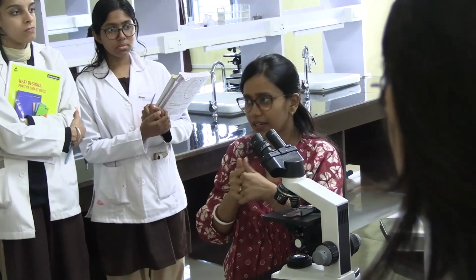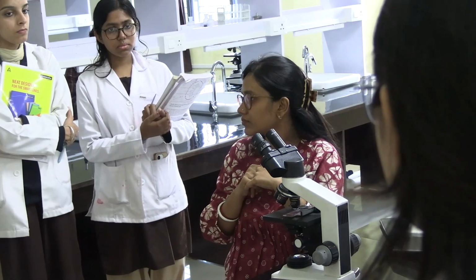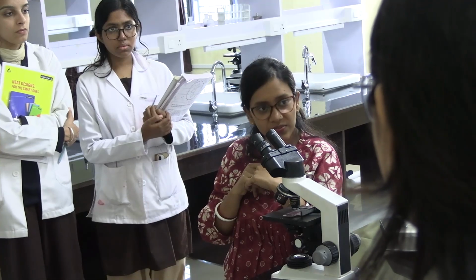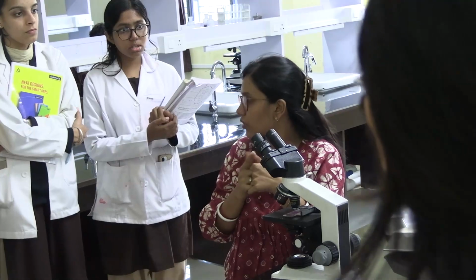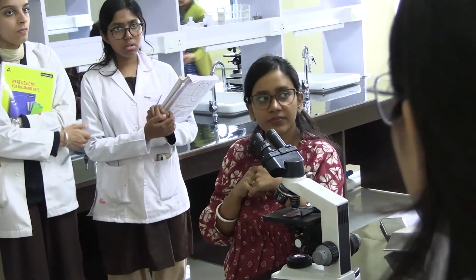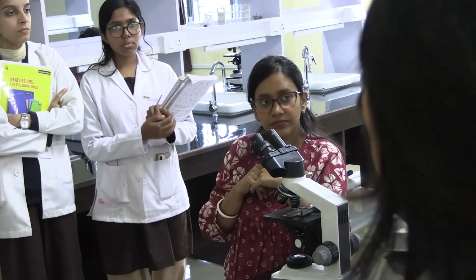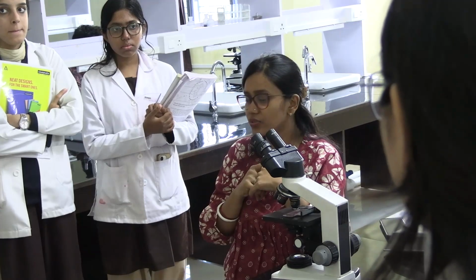Okay. Now you tell me, if I have to say a lesion is malignant, what are the microscopic features I would be looking for? It is irregular. What is irregular? The shape. The nuclear cytoplasm ratio is increased. Pleomorphism. What do you mean by pleomorphism? Nuclear structures. Different types. Irregular cell shape. Nucleus placed differently? No.